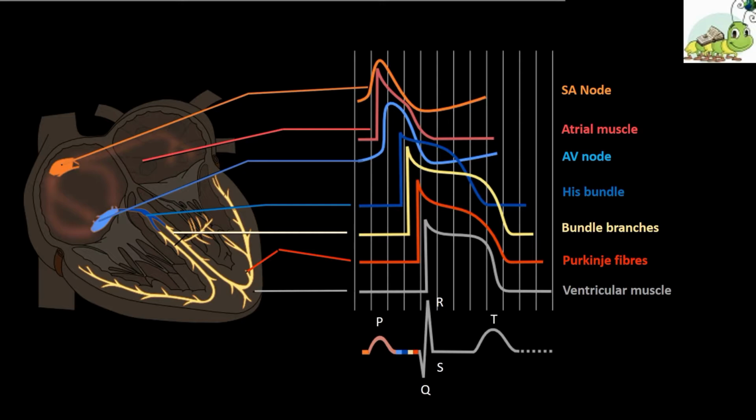So this ECG machine produces a graph. The parts of the image in the graph are: number 1, the P wave, an upward deflection associated with atrial depolarization. Number 2, the QRS complex, upward and downward deflection associated with ventricular depolarization, which corresponds with phase 0 of the ventricular contractile cells. These terms we heard in the cardiac cycle chapter in the previous episode, right?